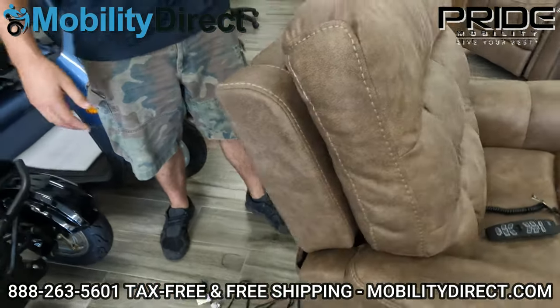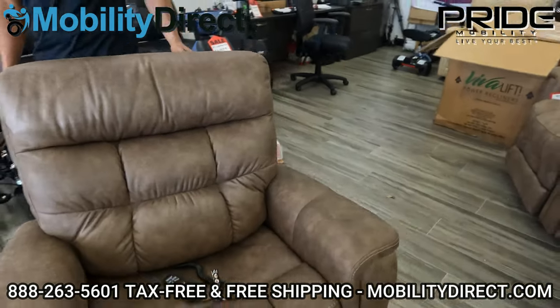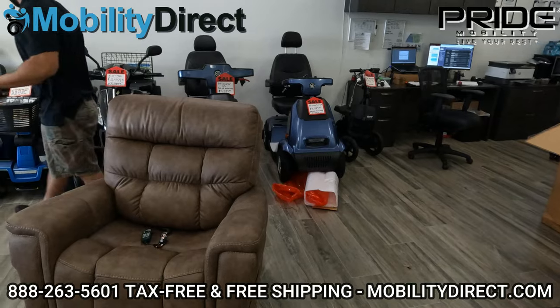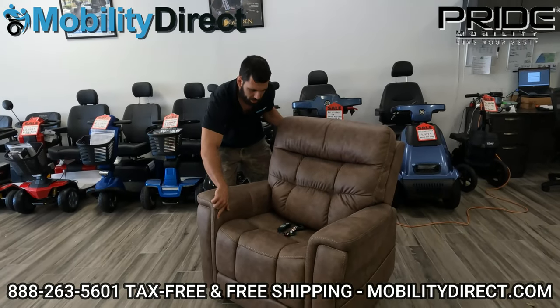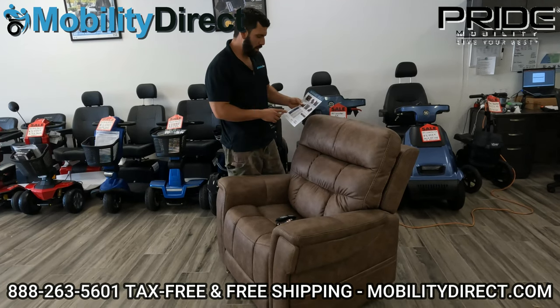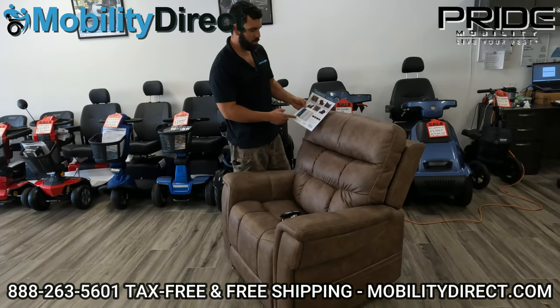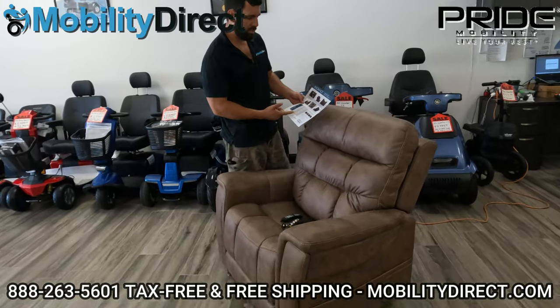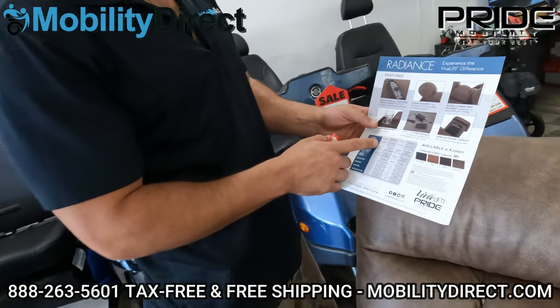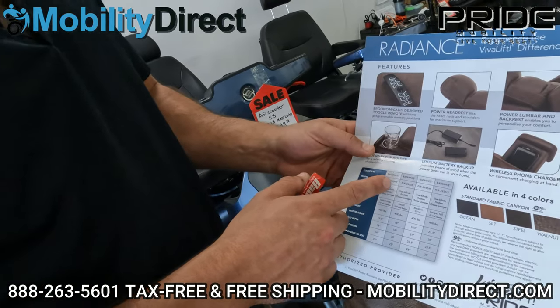Now the chair is fully assembled. At this point we can plug it in — I'm just going to grab my extension cord. The chair is assembled, we have power. I do want to point out that we have on our website a brochure where you can see the size dimensions for all of the different models.